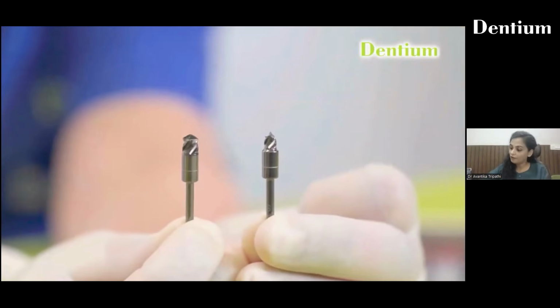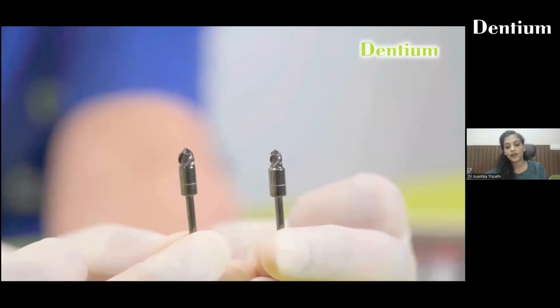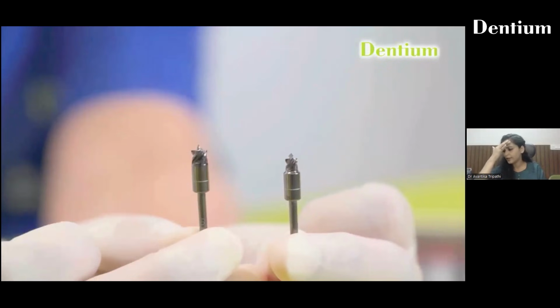There is also a flat drill available, the usage of which is basically to flatten the irregular crest and to create a stable entry point, so that we have a similar platform created, and when we insert our guide drill, it should not wobble, it should be quite stable inside.